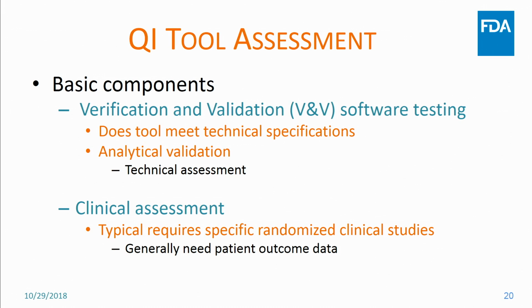This typically requires some sort of randomized clinical studies to associate. So I can make this measurement of volume. I can make this measurement of size. RECIST is always commonly used. There's really no studies that show RECIST has this particular clinical context. It was a measure that's logical. It was sort of made in a framework that logically makes sense, but is 30% the right number on the RECIST criteria? That hasn't been clinically validated, although it's used, and we're going to live with that measure. This requires more data and a more complicated design associated with it.